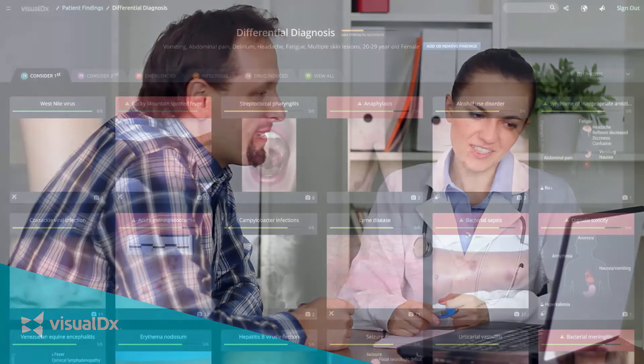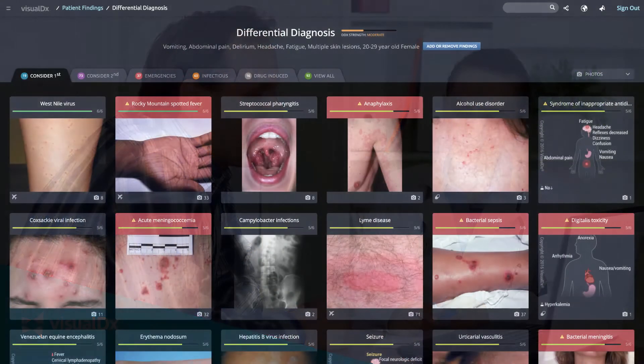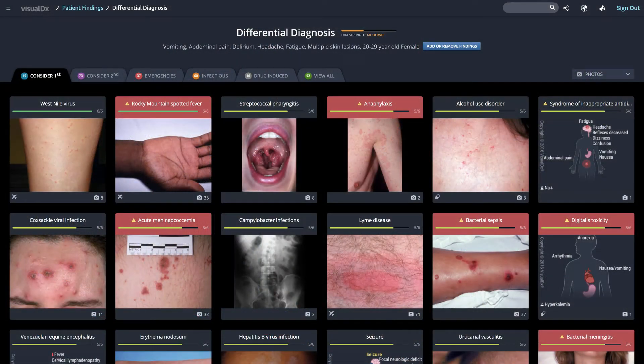Here at VisualDX, we're making it easier for you to both broaden your differential and get to the correct diagnosis quickly with a couple of design changes. Here's the differential of a 27-year-old female with vomiting, abdominal pain, and delirium.